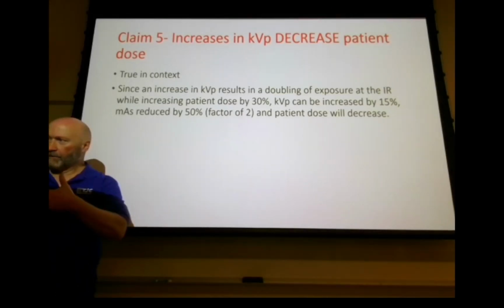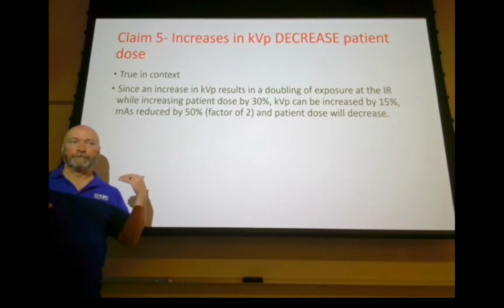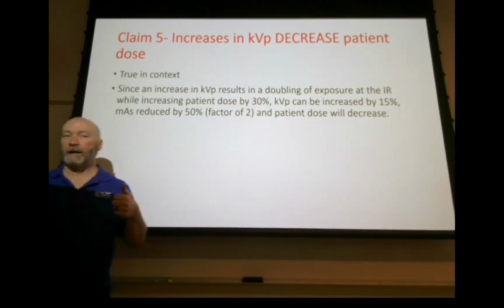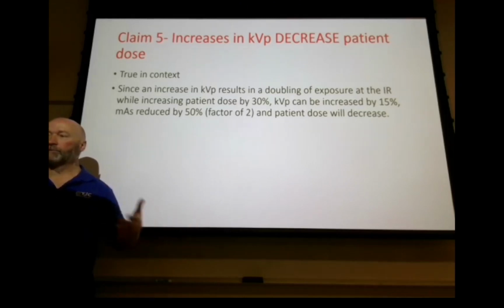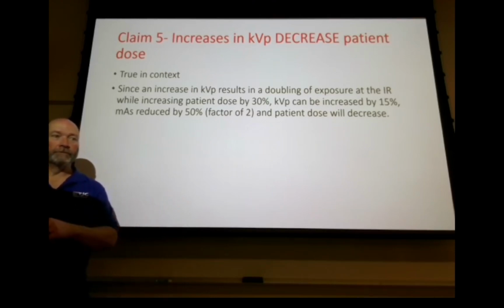They send a signal over to the timer circuit to discontinue the exposure, right? So if you phototime and you increase kVp, what's going to happen? Increase penetration and shorter exposure. You're just going to get to your exposure a whole lot faster. It's going to terminate the exposure a whole lot faster. It works the 15% rule for you.